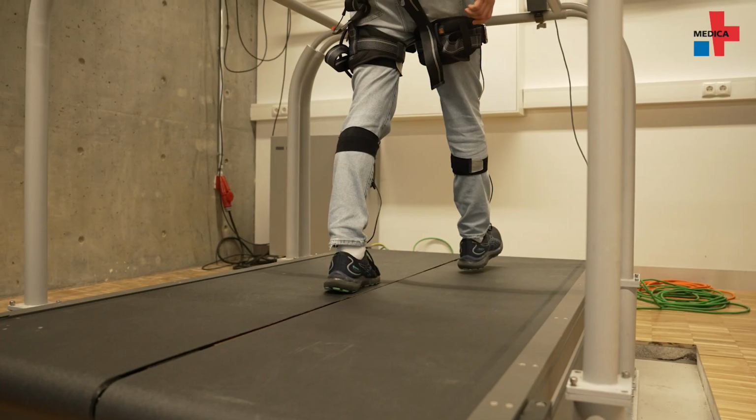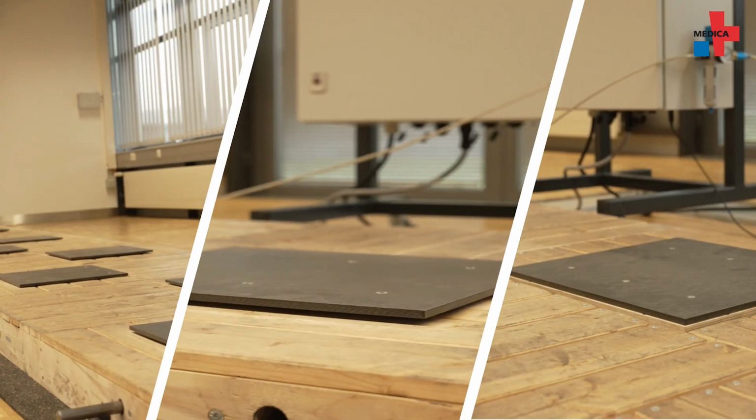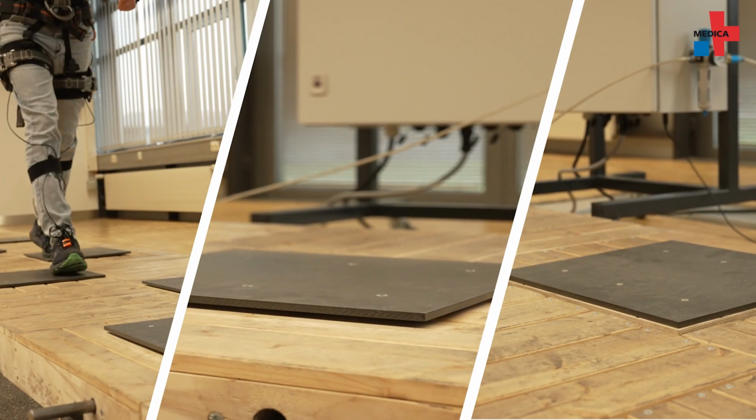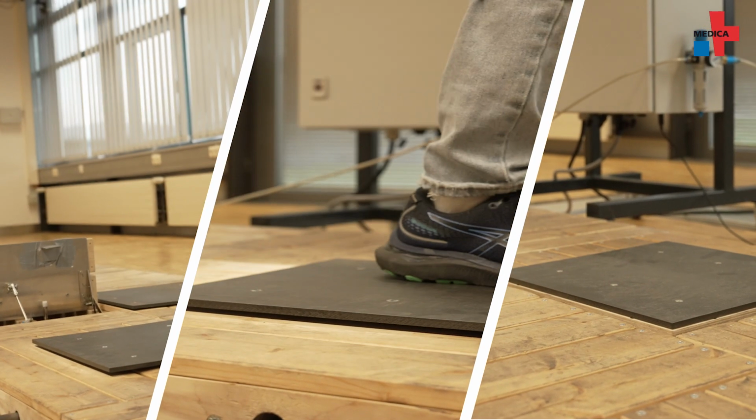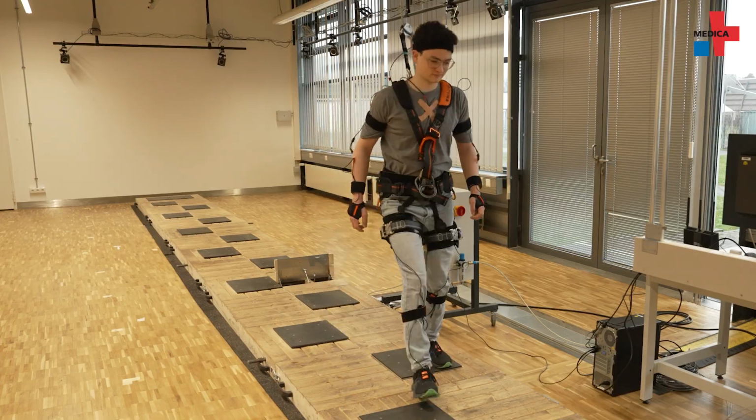She and her team measure many parameters in the process. We can then use the force plates to measure the forces acting on the body and then draw conclusions about the forces acting within the body. In our working group, we also do a lot of research into how this affects the muscles and tendons, particularly in the lower extremities. We have developed this gait course ourselves, and we can generate tripping, slipping, and misstepping events. These are very unpredictable for the participants who then walk across this course.